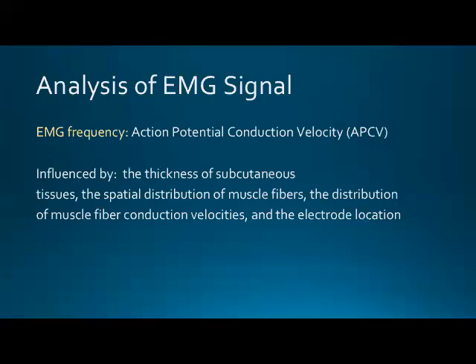There are different results in the literature in terms of how much body fat is actually going to significantly alter the signal to where it's not usable. But usually if you're staying within the normal accepted ranges of average male, average female percent body fat, then you're not going to see a huge influence from that subcutaneous fat layer on the signal. When you start getting into the overweight and the obese category, then you're going to see some differences and decreases in both the amplitude and the frequency signal, just because it's further away from where it's being measured. Would that still be an issue if you're doing invasive? Obviously, not as much, no. It's just going to limit the type of activity you could do.